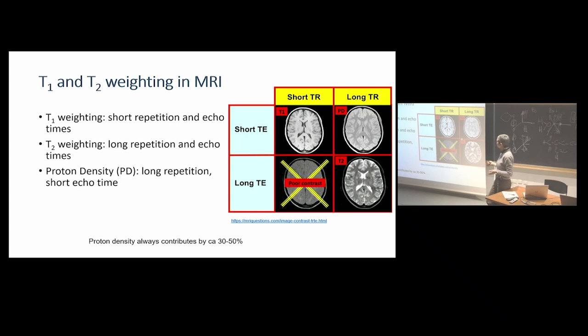radiologists use. So it's a T1 weighted, a proton density weighted, and a T2 weighted, and you see the images of the human brain here look quite different. And you can achieve these different weightings by just changing these sequence parameters, so echo times and repetition times. And these images would typically be done with spin echo sequences.